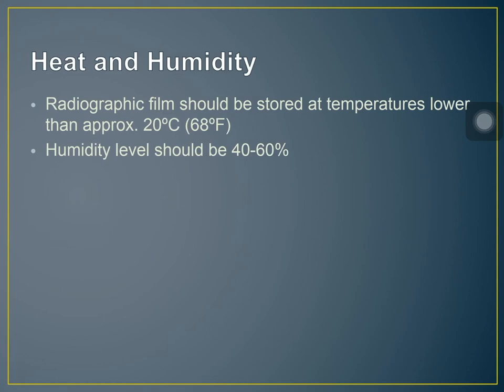Those fog adds some density on our radiograph. So, radiographic film should be stored at temperatures lower than approximately 20 degrees Celsius or 68 degrees Fahrenheit. So, humidity level should be 40 to 60%. Heat increases the fog of a radiograph and therefore reduces contrast.